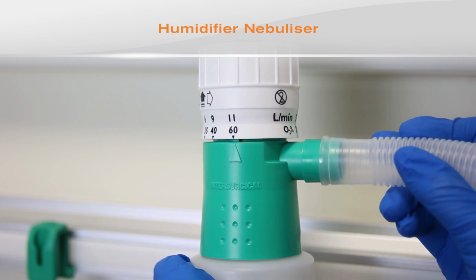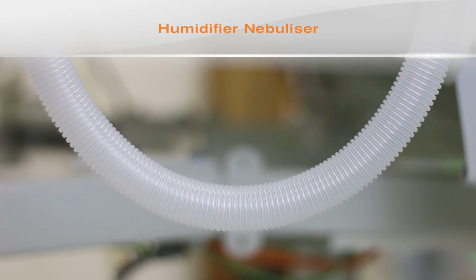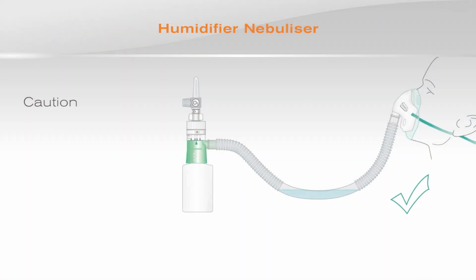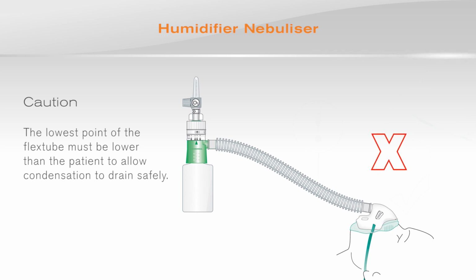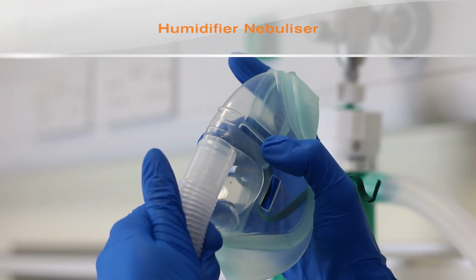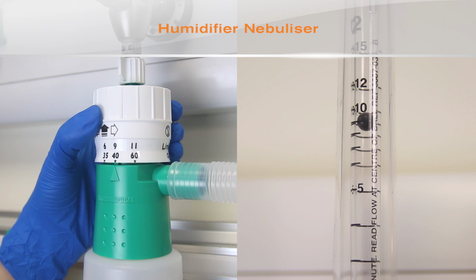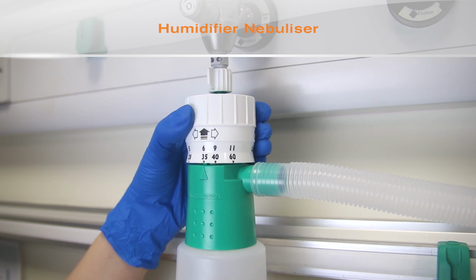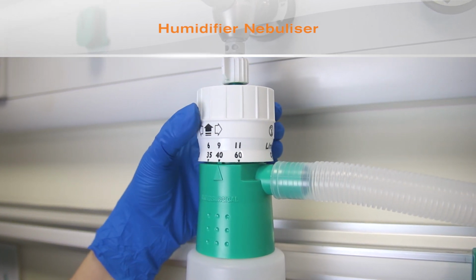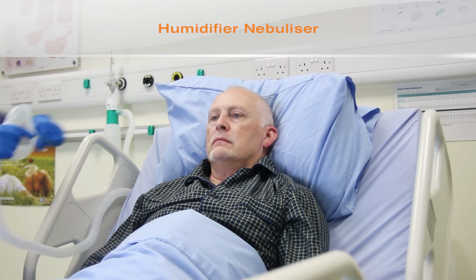Attach 22mm flex tube to the outlet of the humidifier nebulizer. It is important to position the tubing so that the lowest point is below the patient and to regularly drain any condensate to prevent any condensed water from running into the patient or occluding the flex tube. Attach the aerosol mask and then adjust the oxygen concentration to the required level. Set the flow meter to provide the required total flow to the patient. The intersurgical Aquamist makes this simple by indicating the appropriate flow above each oxygen setting. Then fit the delivery device to the patient.